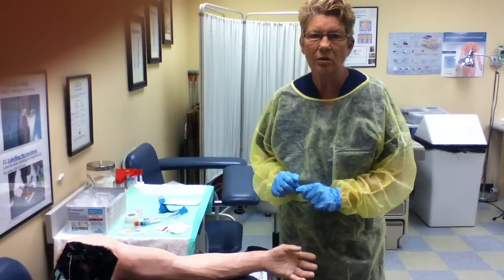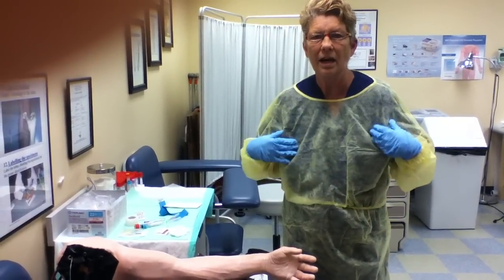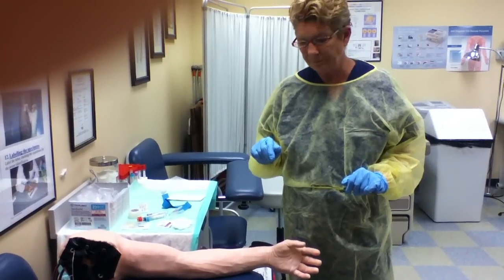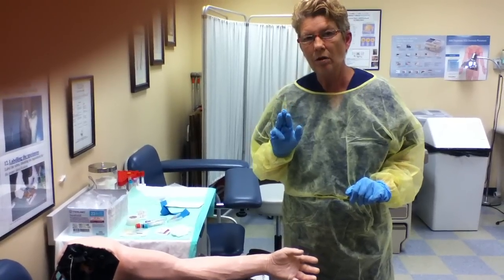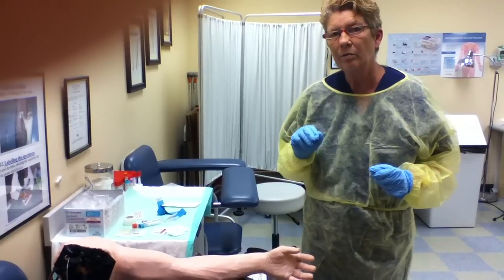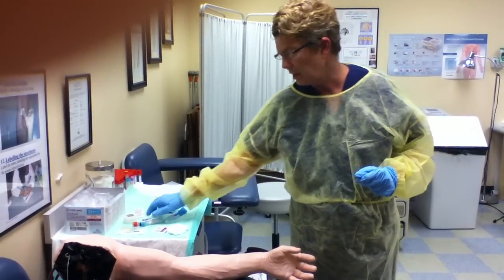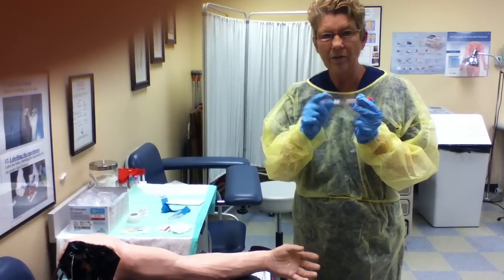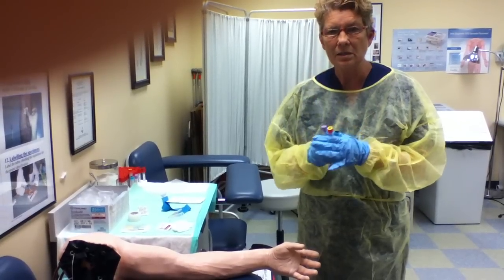I've washed my hands already. I've donned gloves and I have a gown on. Tonight I'm going to be doing a three lab draw — the rainbow set that I explained in my PowerPoint slides. It consists of a blue tube, an SST tube with a separator in the bottom, and a CBC tube.